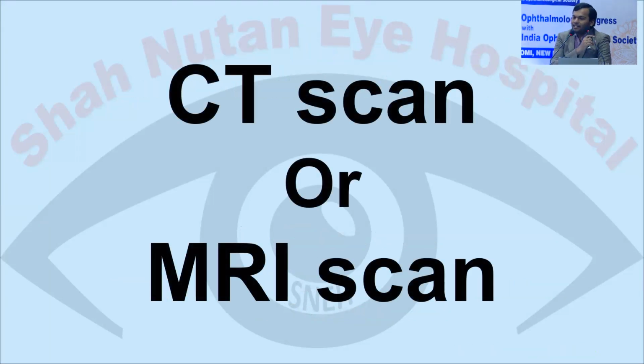So the first thing is when to look at the CT and when to look at the MRI of orbit. Whenever we have a case of proptosis, the screening tool can be a CT scan, because the orbit has a lot of fat which provides a contrasting medium, and very well-defined lesions can be easily seen on CT scan. Plus, whenever we are planning an orbitotomy surgery, we need to look at the bony anatomy. Where is the cribriform plate, where is the anterior cranial fossa, how low is the roof of the orbit, and accordingly we can plan creating the bone window for lateral orbitotomy, and hence CT scan helps there. MRI has its own uses and we'll come to that eventually.